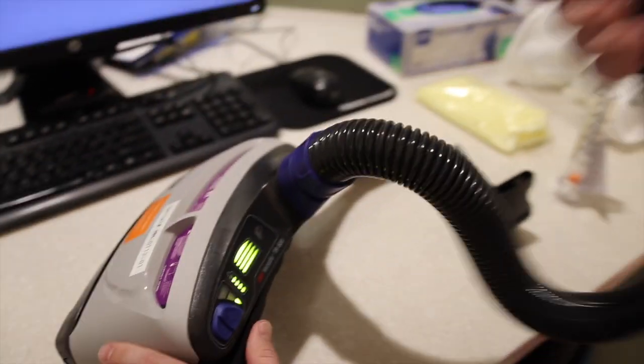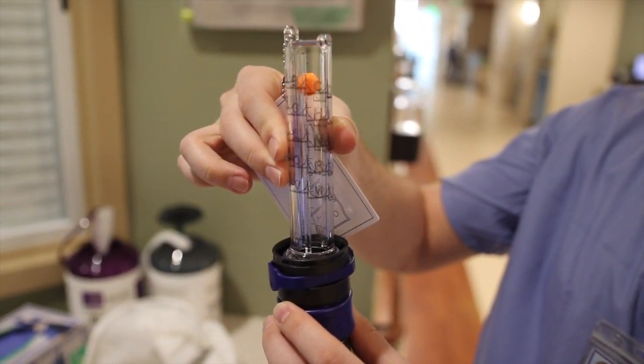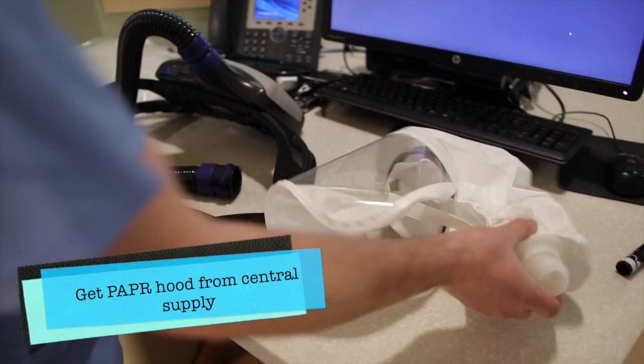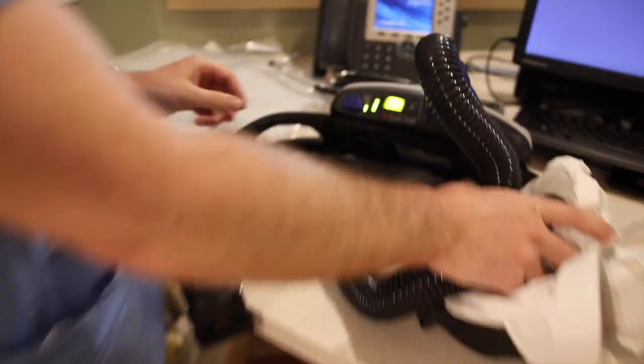If the device is powered up properly, you'll next want to test the amount of positive pressure by placing the measurement tool on the end of the hose. If the ball floats to the very top of the device, you have adequate positive pressure. This measurement device comes with an attached instructional card for proper use in colder temperatures. Next, you'll want to ensure that your hood attaches properly to the unit. Attach your hood, ensure that air is flowing, and then go ahead and power down the unit.